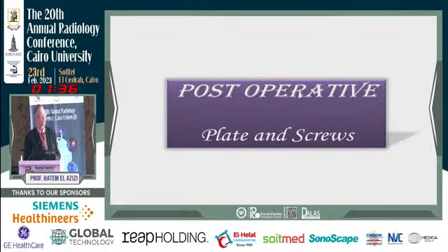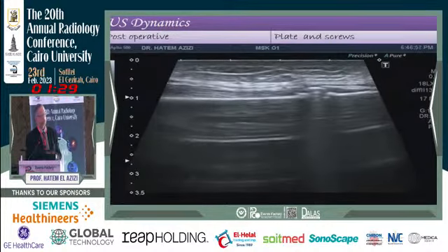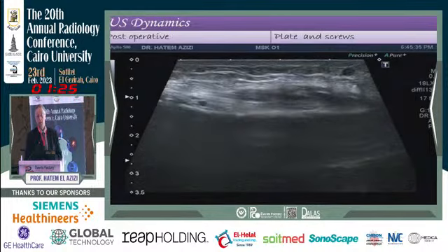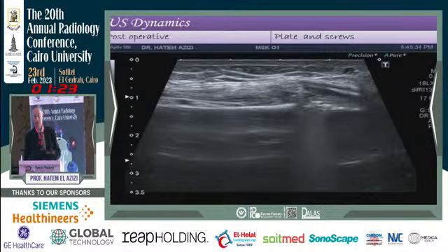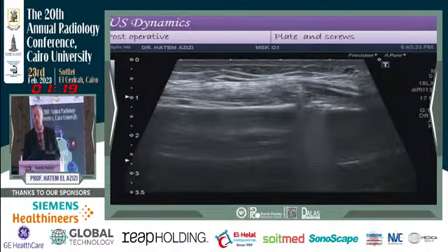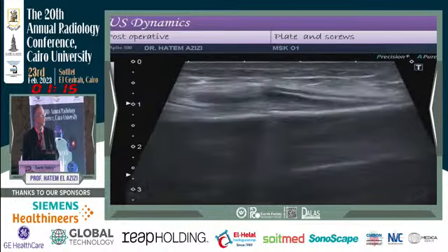Plate and screws. This group of cases, patient, post-operative, this is the head of the screws. Another screw, we can see this. Is it the cause of the pain of the patient? We need to take a decision, remove this screw or not. Okay? Again, solving by dynamic ultrasound.